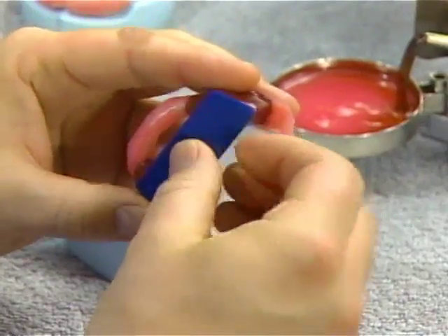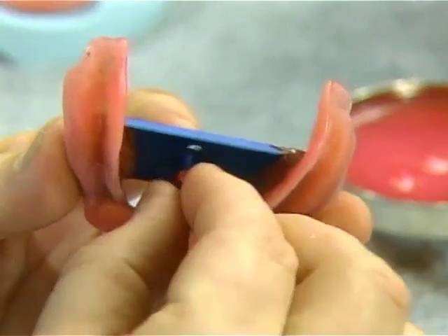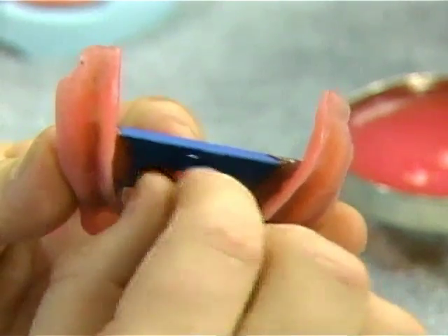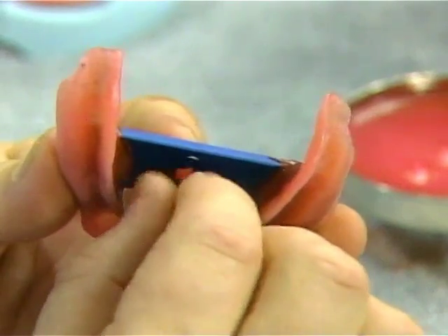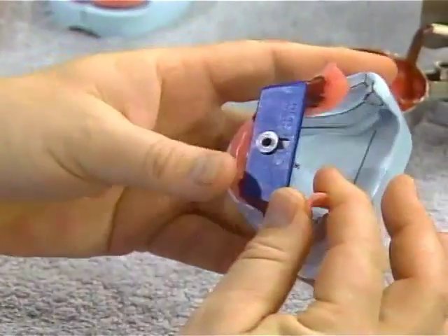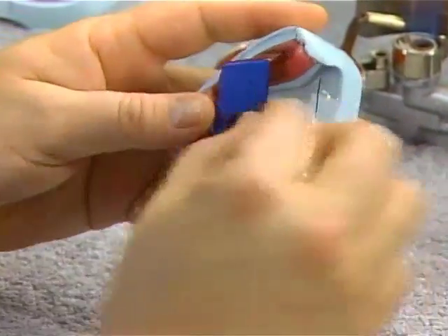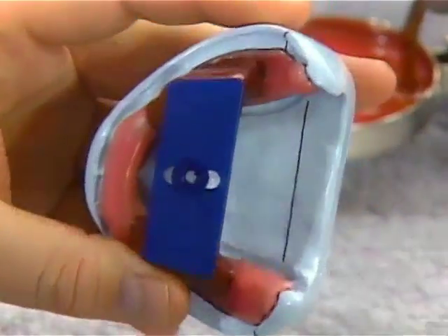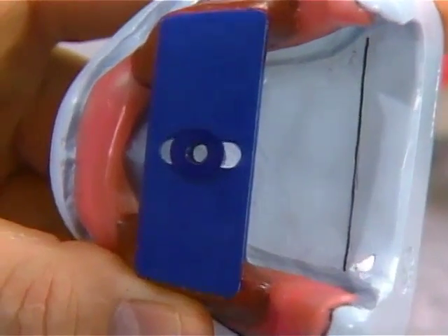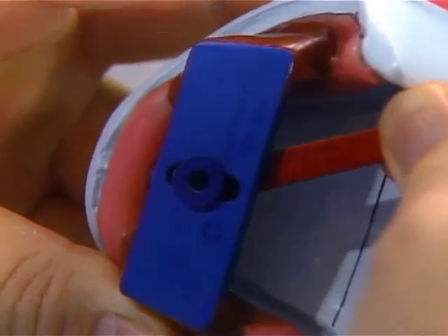Place the blue sleeve in the slot with the flat disc on top. Turn the bar over and screw the red hex nut onto the sleeve. Looking straight down, position the hole in the sleeve 2 millimeters anterior to the X marked on the cast and secure it with the hex nut.